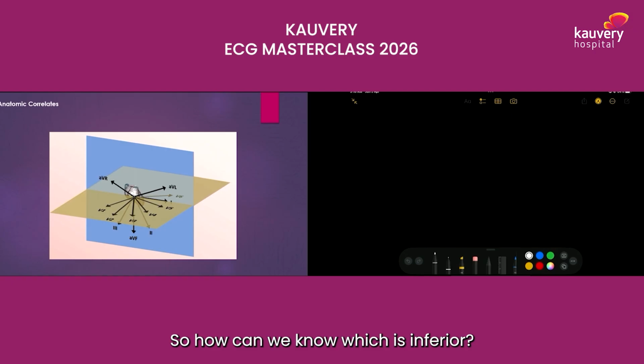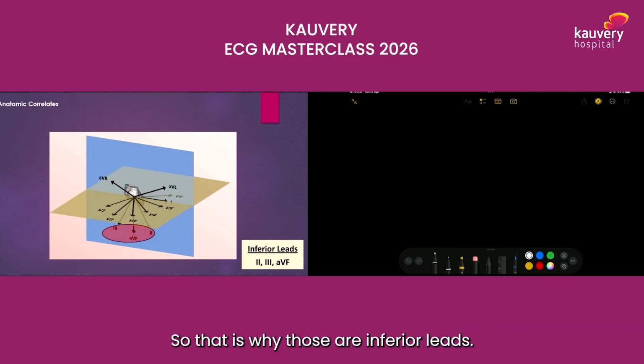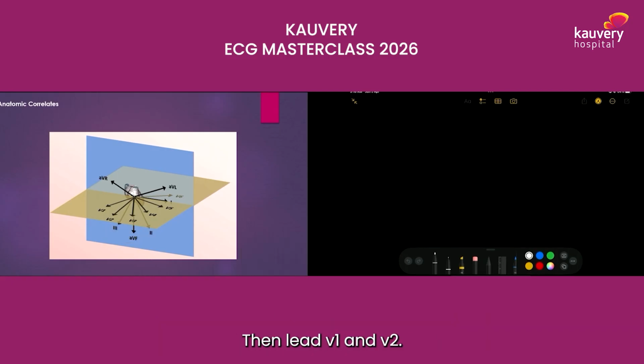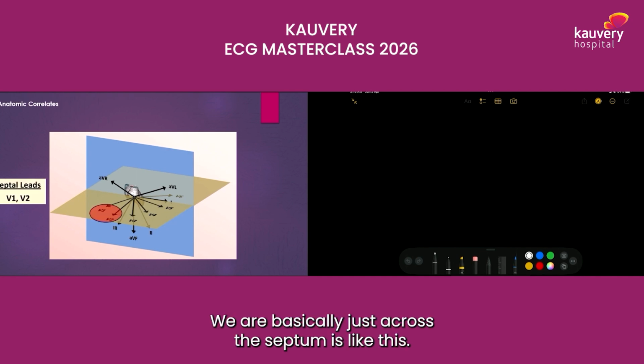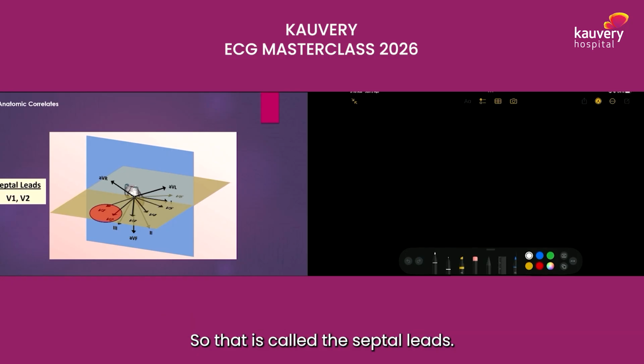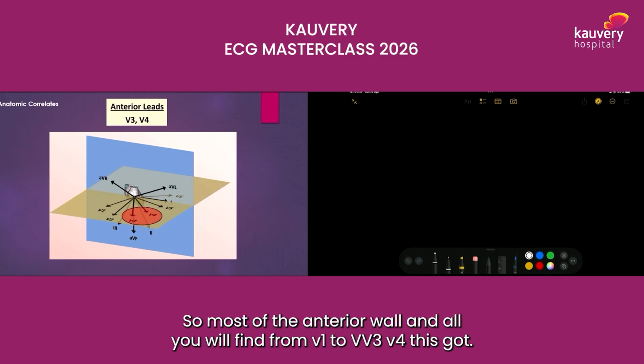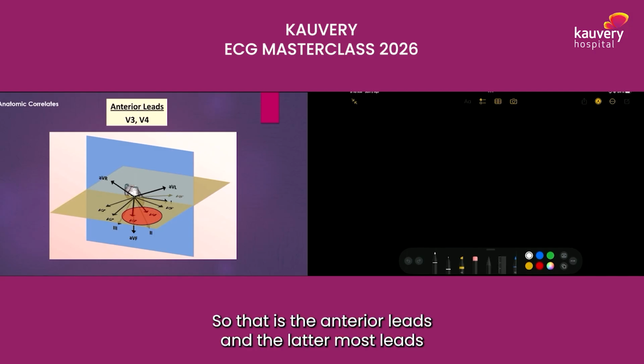So how can we know which is an inferior lead, which is a superior lead? As we see, lead 3, AVF and lead 2, we are viewing the heart from below. That is why those are inferior leads. Then leads V1 and V2, the septum is like this, and we are seeing the heart from across where the septum is in an en-face view. So those are called the septal leads. Then we have leads V3 and V4 where we are seeing the anterior aspect of the heart. Most anterior wall MIs, from V1 to V3, V4, have ST elevations. So those are the anterior leads.